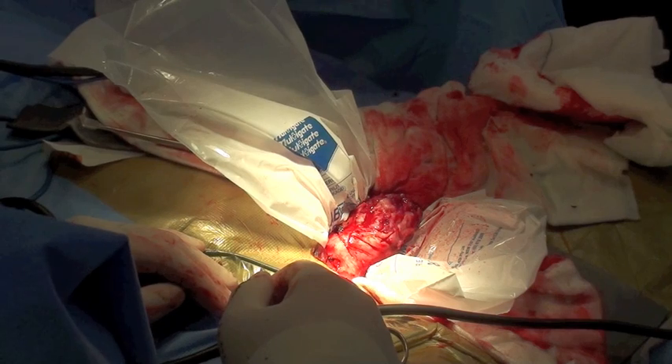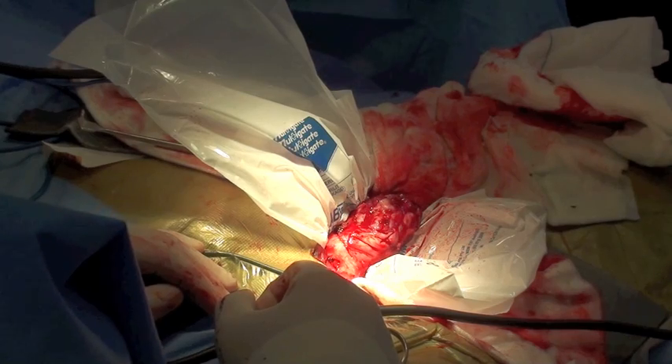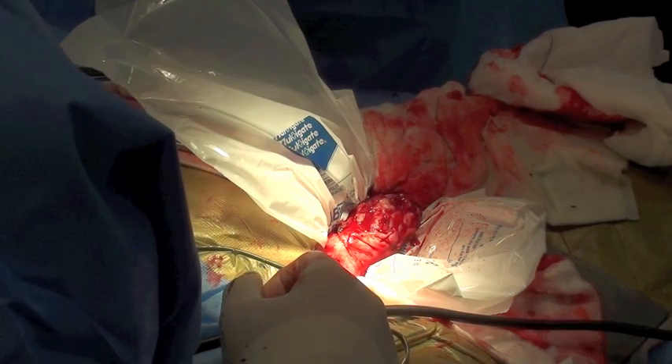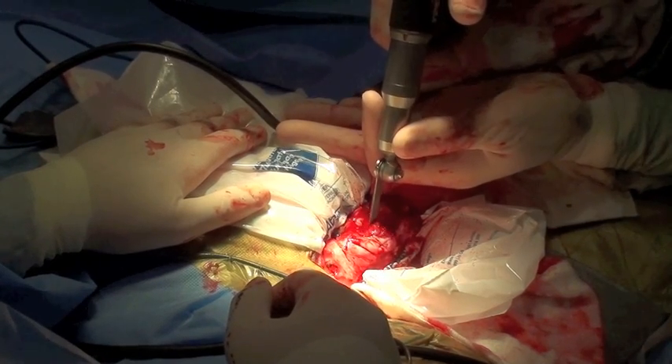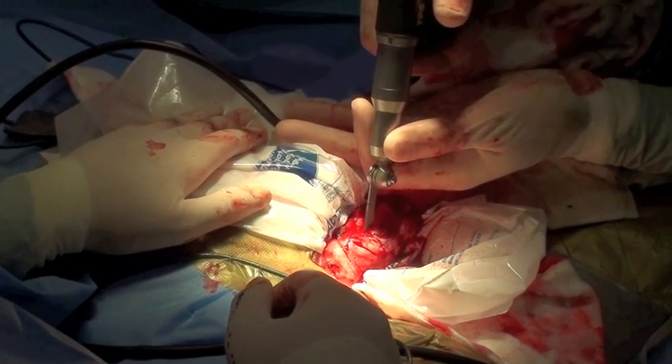Plastic bags are placed around the bone in order to prevent seeding of the tumor once we perform the osteotomy. To debulk the tumor volume, a saw is used to make a window in the lateral aspect of the humerus in order to allow access to the medullary canal of the bone.